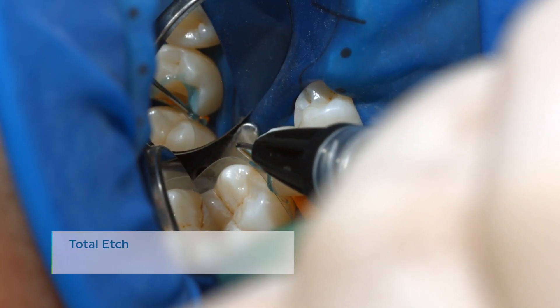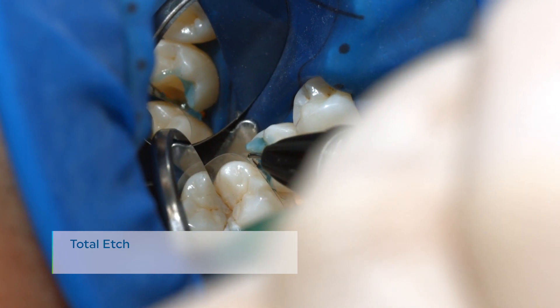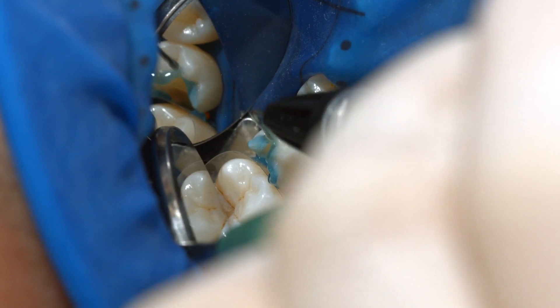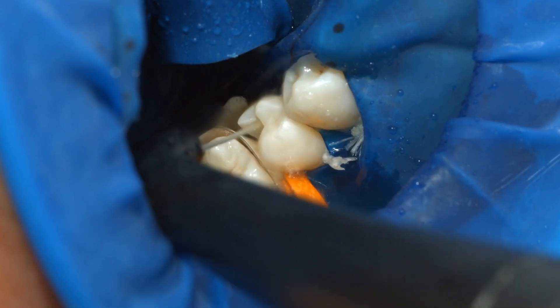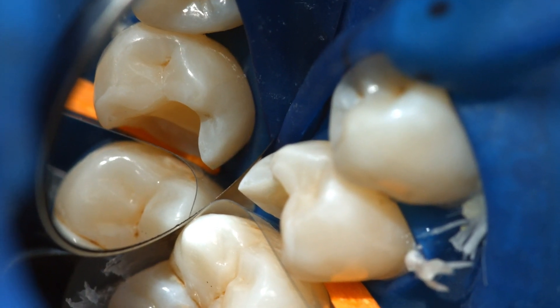Apply Phosphoric Acid Gel, for example Total Etch, to the enamel and allow it to react for 15 to 30 seconds. Thoroughly rinse off the gel with a vigorous stream of water and air dry the preparation until the enamel surfaces appear chalky white.